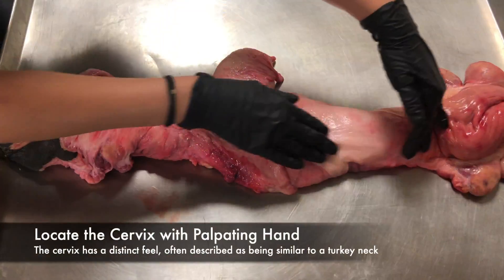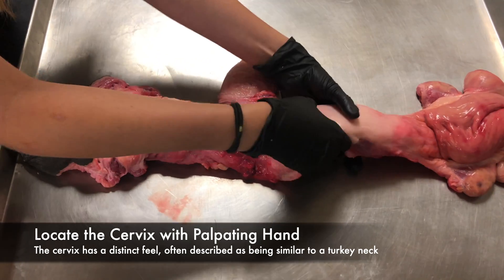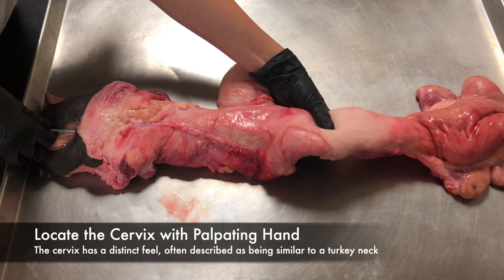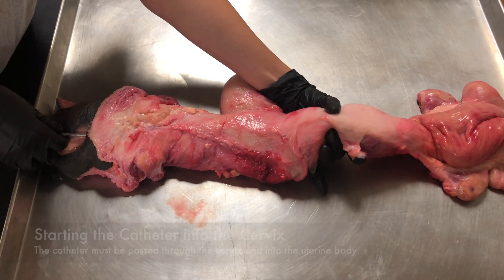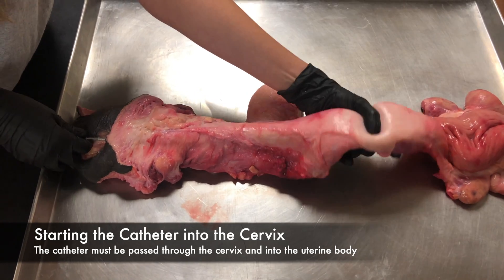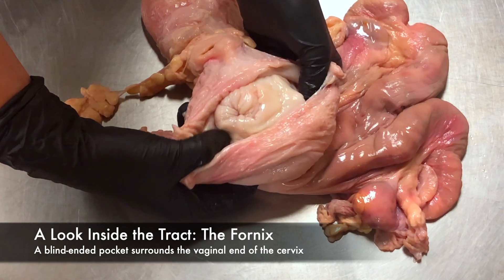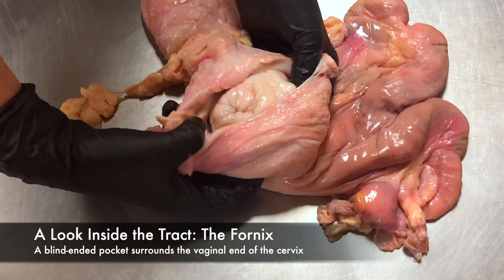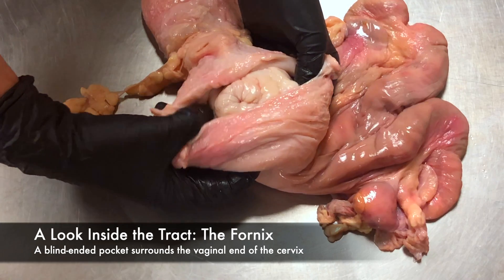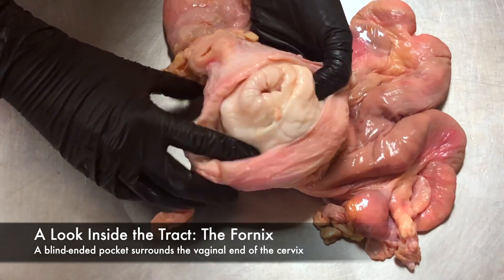It is possible your catheter will already be in contact with the cervix, but if not, palpate the tract and find the cervix. The cervix will vary in size and shape, but all have a distinct turkey neck feel. When you have brought the tip of your catheter close to the cervix, the next step is to insert the tip of the catheter into the opening of the cervix. This can be challenging. Around the cervix, the vagina forms a blind end of pocket called the fornix. It is very easy for the tip of the gun to simply be in this pocket rather than at the opening of the cervix.